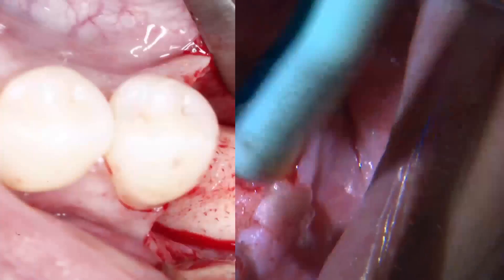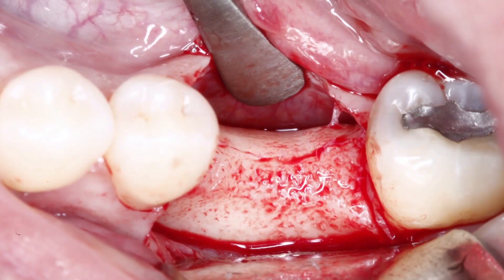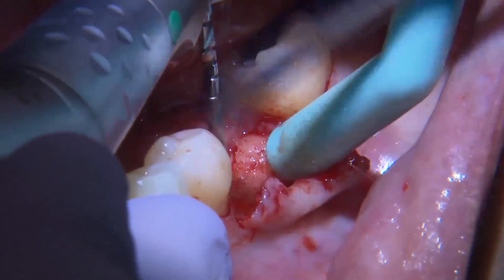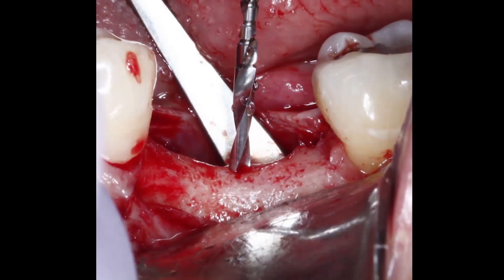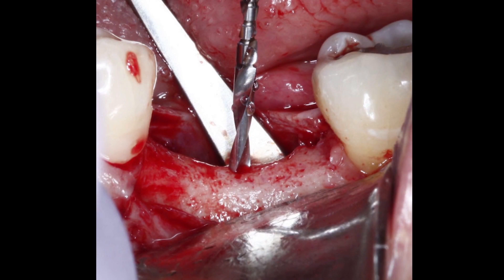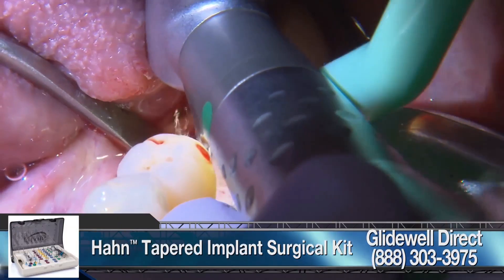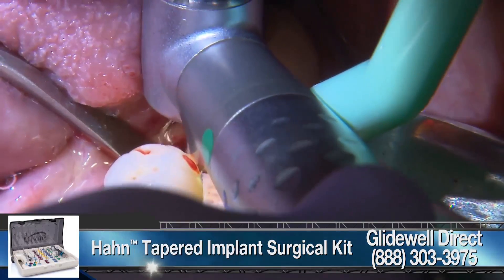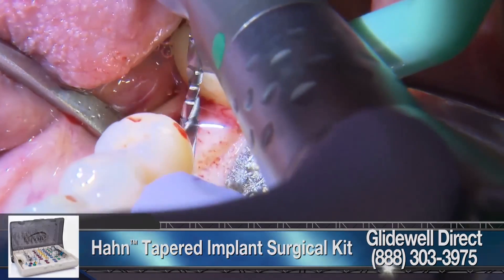Step one: have access and be able to visualize where I want to place the implant. Step two is to go ahead and create my initial osteotomy with the start drill. The start drill allows me to follow up with additional drills in order to deepen and widen my osteotomy so that I can place the implant.